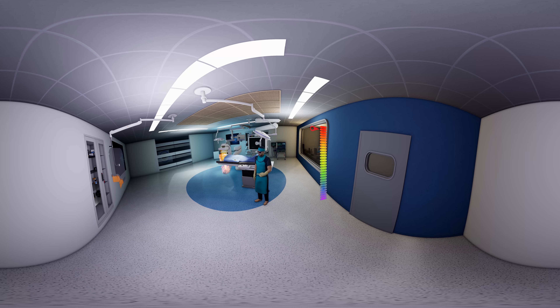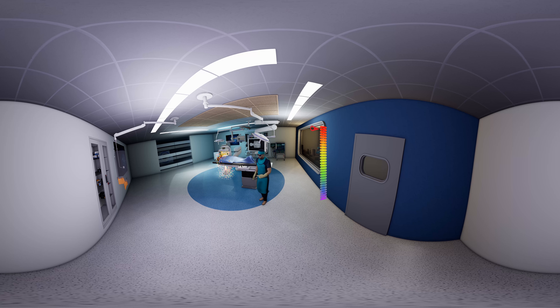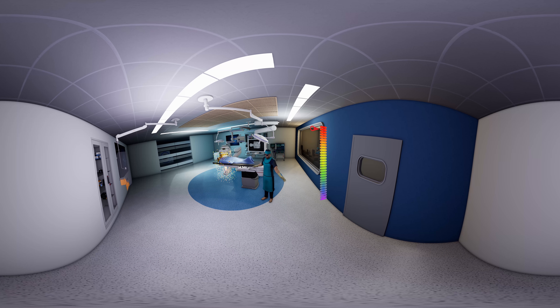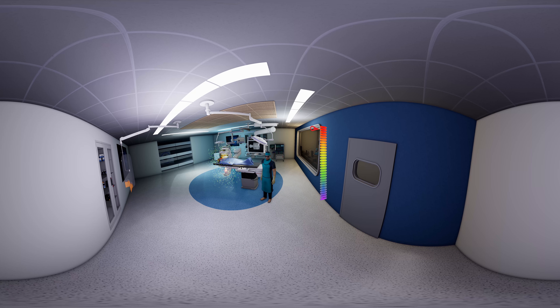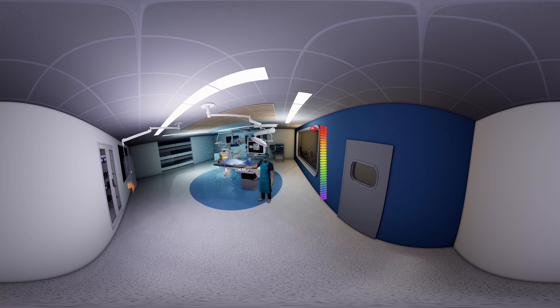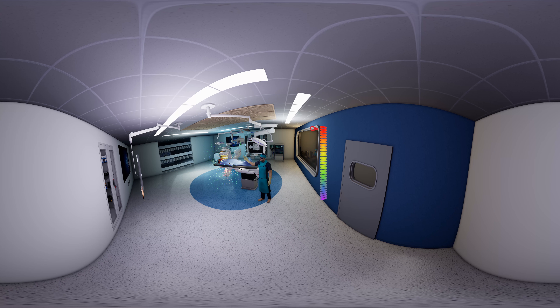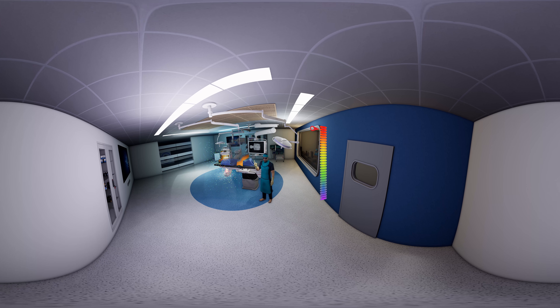When x-ray passes through the patient it carries information that creates the image. The radiation spreading all around is the scattered radiation, which comprises the main source of dose exposure to the medical staff. Mavic offers long hybrid suspension arms that carry shields and light systems that effectively avoid collision with the crowded ceiling space and bridge the laminar air flow in the room.